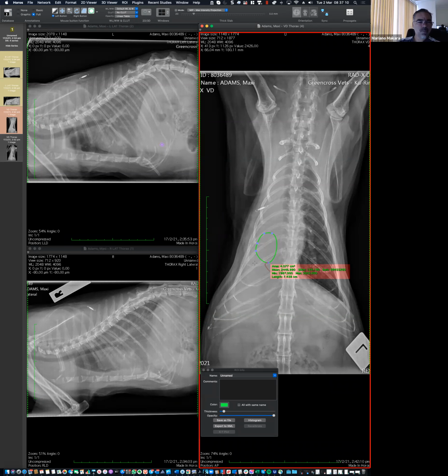If you go in the book, they're going to say that something that affects one side of the lung, then basically you need to be thinking about something either in the vessels or the airway up where there is that division.